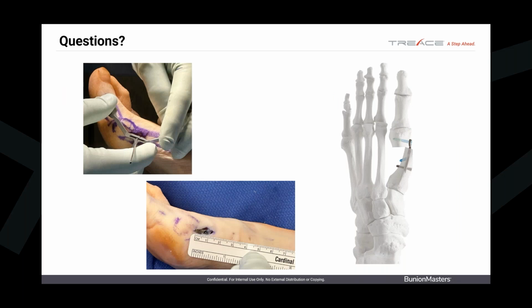is not violated. So it's still rotational, it's still congruent, it's still dorsiflexing. So the patient doesn't need to transfer the weight over. It still propels off of the rectus first metatarsal. So take the number of cases I have, which are very large. I treat almost no post-op metatarsalgia at all, and feel comfortable that the shortening you get, one, is tolerated, but number two, it decompresses the joint a little bit.